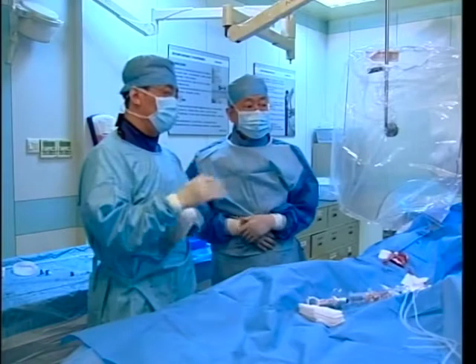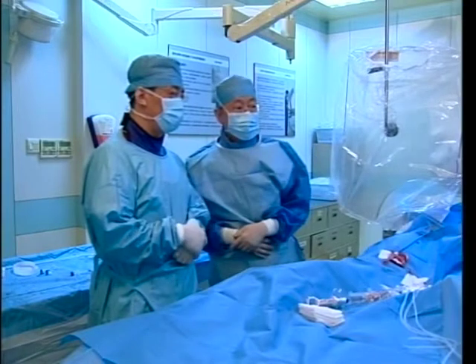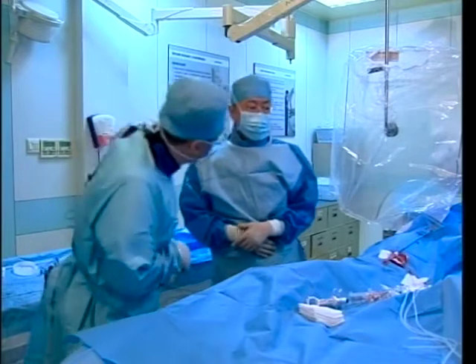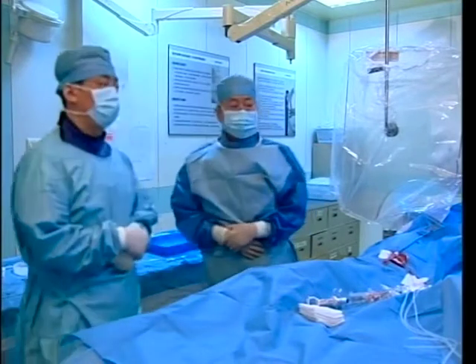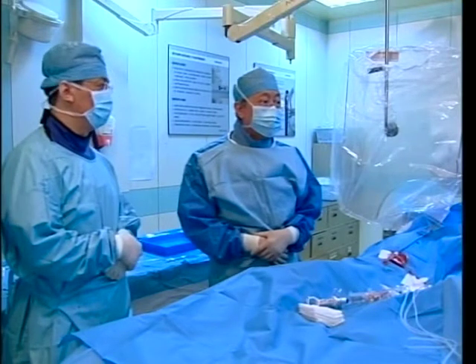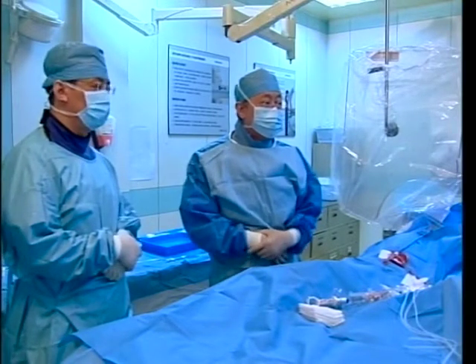Here with a very distinguished panel and very excited to open a live case session on left atrial appendage occlusion. So it looks like we are ready to go live to FUWAI Hospital.